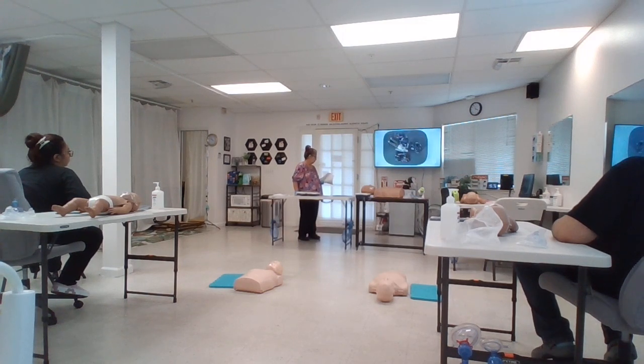Stop CPR. Switch. Stay hovering. Shocking. Everybody clear. Shock goes.